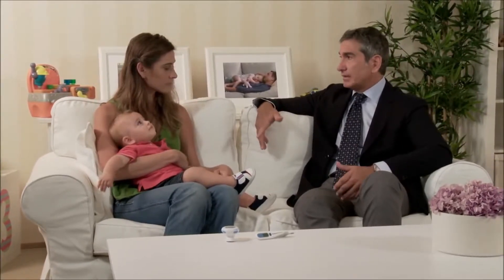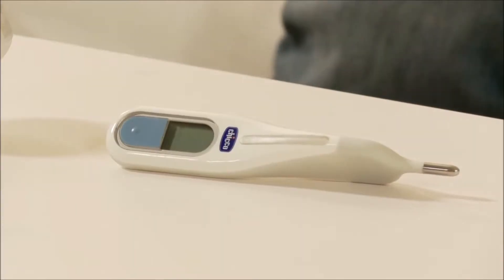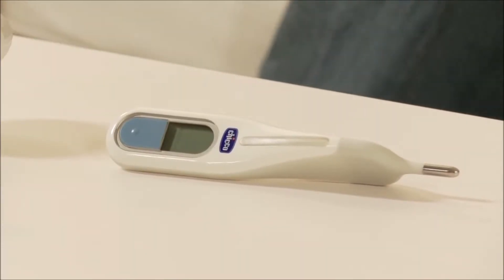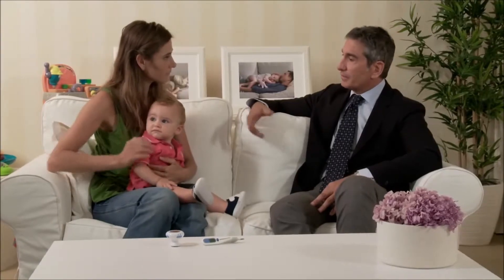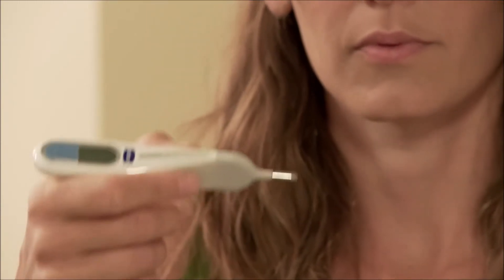Even in this case, there are different types of digital thermometers. Some have a softer and longer rod, whilst some have a more anatomical shape and a shorter probe, so the child is more comfortable. It is also possible to lubricate the probe with Vaseline before inserting it.